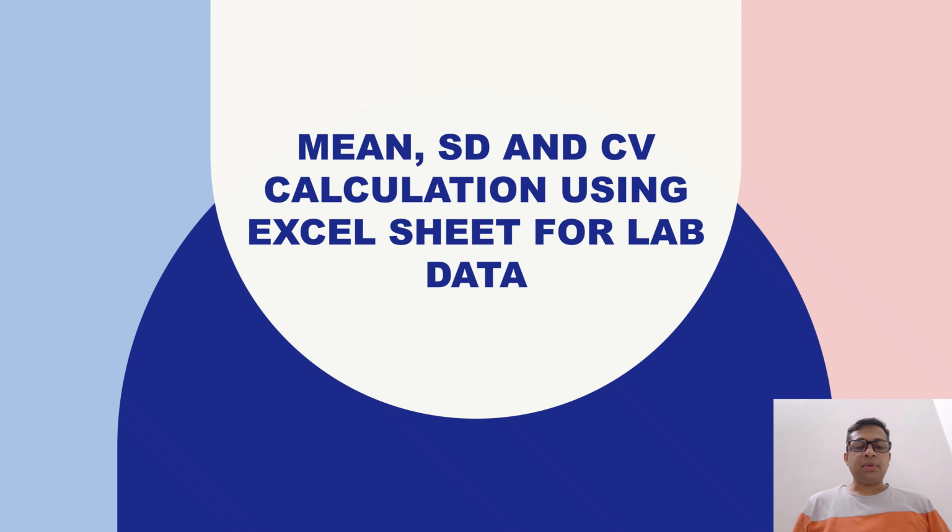Hi, I'm Dr. Deepak. Today we will learn how to calculate mean, SD and CV for lab data using the Excel sheet. Before going actually into the calculation, why do we need mean, SD and CV?